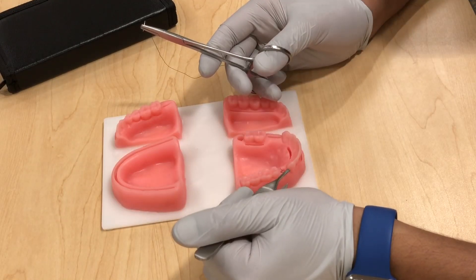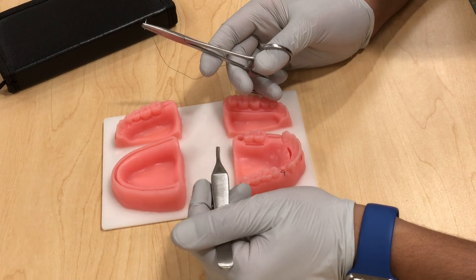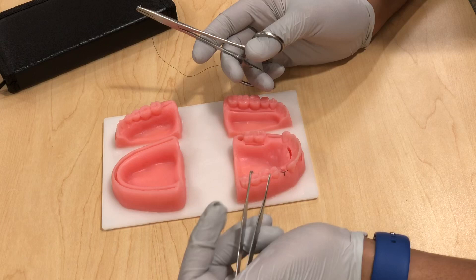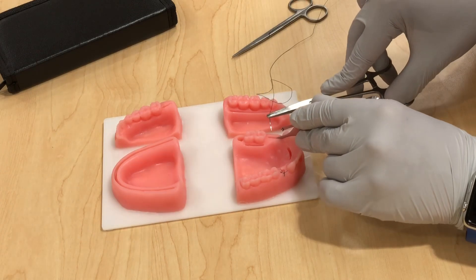Our second technique for today is the figure of eight. This technique is very useful in the case of gel foam and socket preservation, and if you have medicinal material you want to keep in place for a dry socket. As discussed earlier, you always want to go at around 90 degrees to the incision and 1.5 to 2 millimeters away, and always assess how deep you want to go.